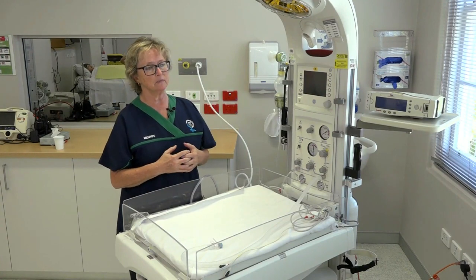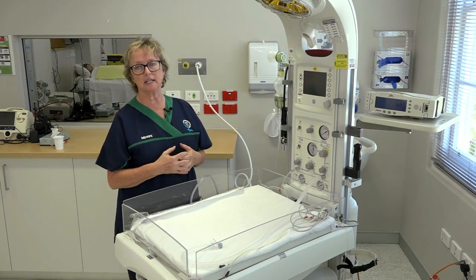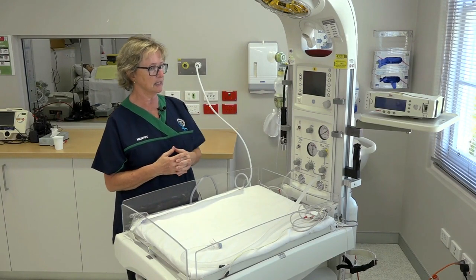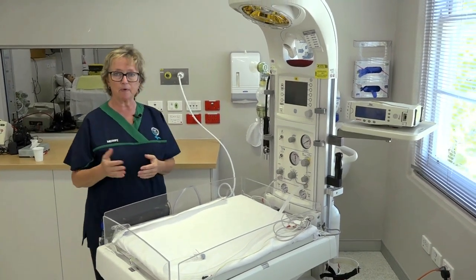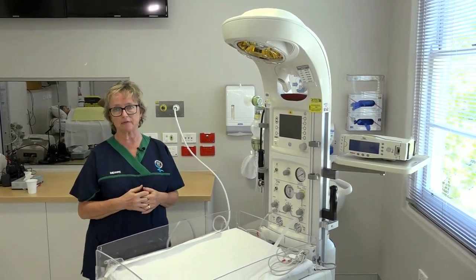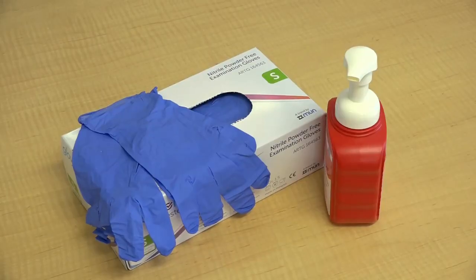Another commonly used cot in Western Australia is the GE Panda Warmer, and you can see it's a slightly different shape. In preparation for a resuscitation or a birth, we have to undergo our five moments of hand hygiene.